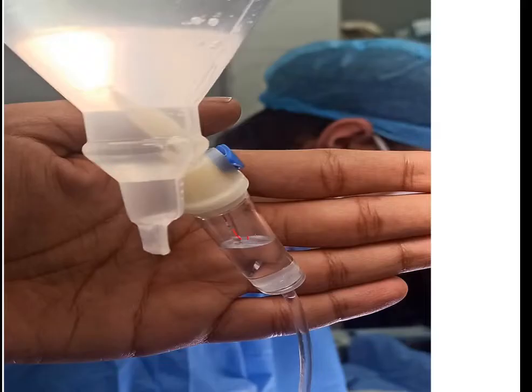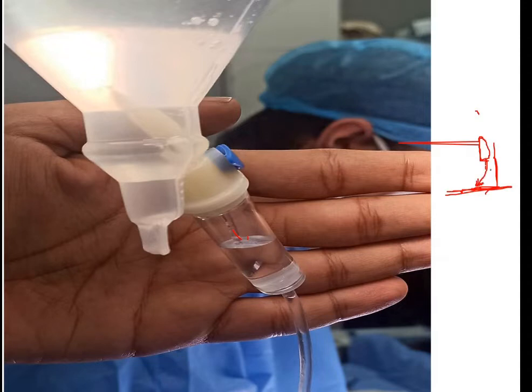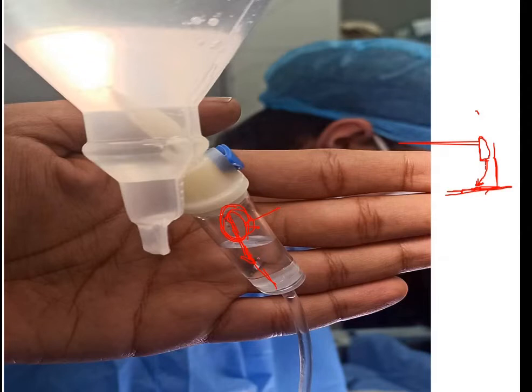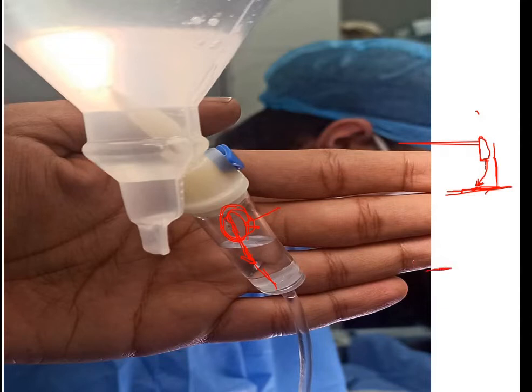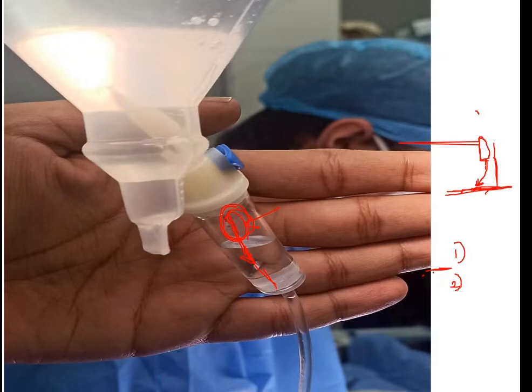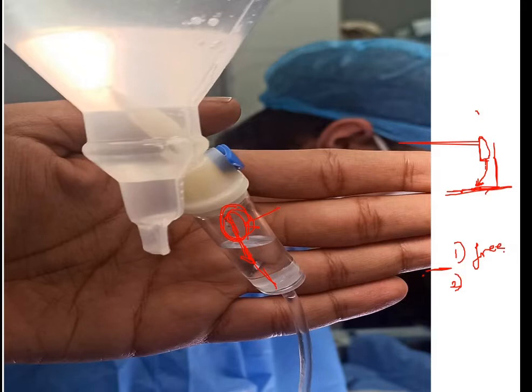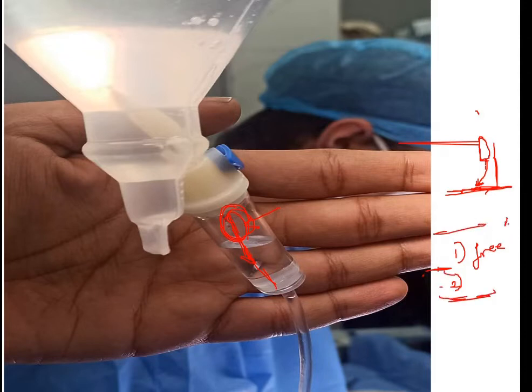Now we connect the PD fluid to the gray cannula. There should be a very free flow of fluid entering the peritoneal cavity — if it is in the pre-peritoneal space, there may not be a free flow. Once free flow is confirmed, we infuse up to around one liter of fluid, depending on patient size, creating an ascitic space. The patient will feel coolness and some abdominal fullness but no pain if the catheter is truly in the peritoneal space. By abdominal palpation, there should be diffuse enlargement with no localized collection.